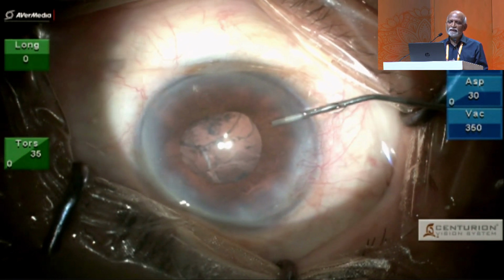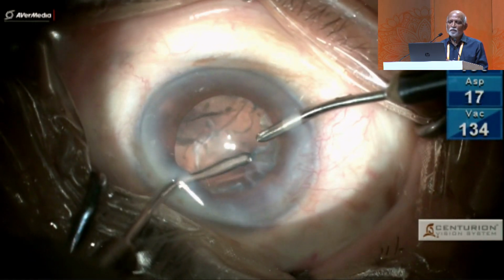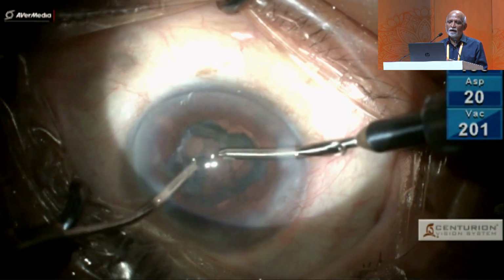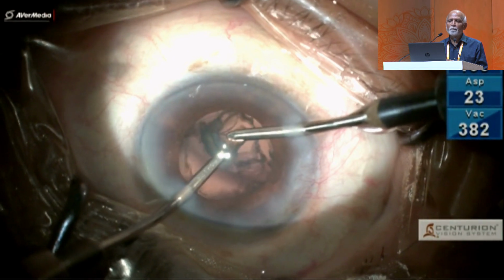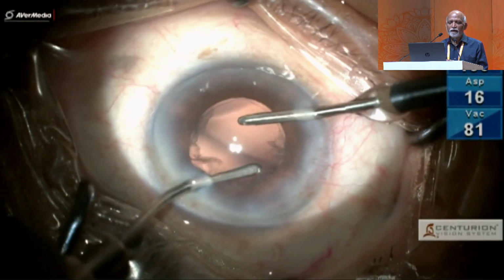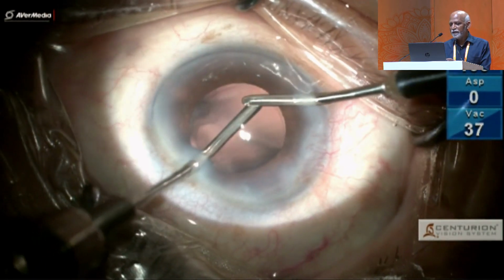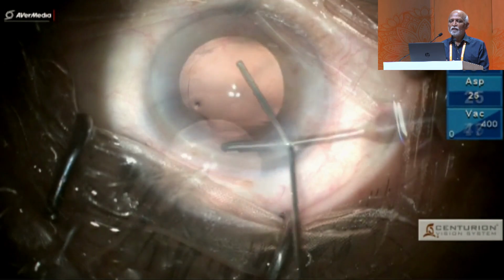So the take-home message is, whenever the pupil becomes small, you should not proceed, but you should start thinking about enlarging the pupil by injecting epinephrine or adrenaline into the anterior chamber, and you can see how things become so simple from here on. You can even put in a pupil dilating device at this point of time in case the pupil doesn't respond to the intracameral adrenaline. So never operate or continue to operate on a small pupil.